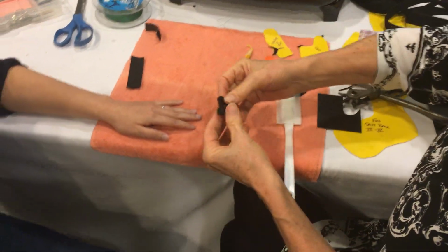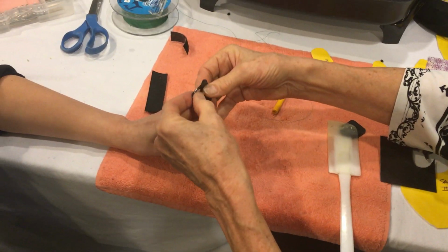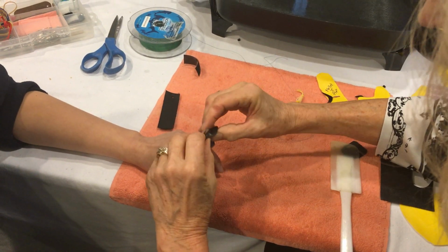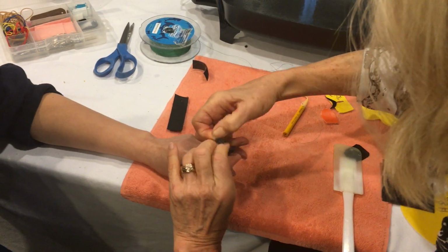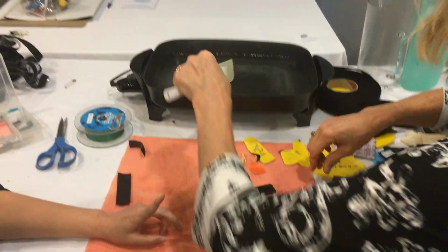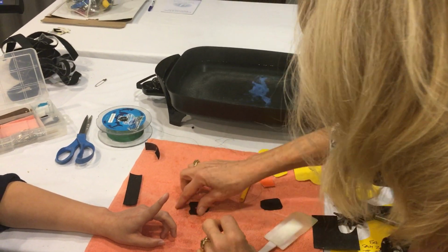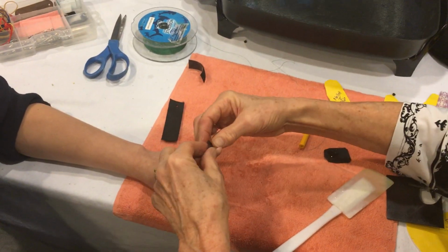Okay, so what I'm going to do is push her finger down through the first hole, up through the second hole. They were pretty close together. They should be a little further apart than that. Oh, the material's stuck together. Let's try that again. If a patient does have fingernail polish, which I don't think you do, do you? No. It can stick. So we're going down through the first hole, up through the second hole.